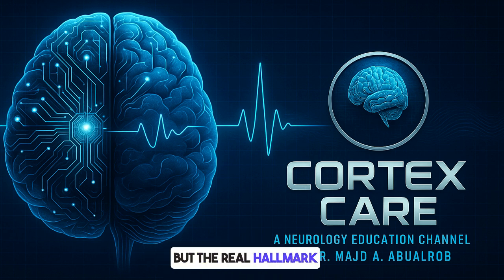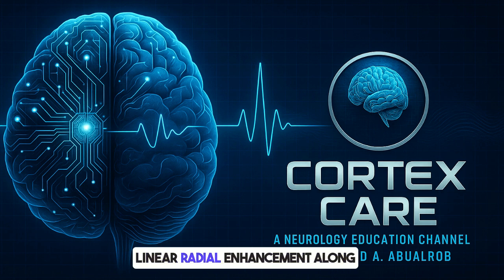But the real hallmark... What's that? Is a characteristic pattern of contrast enhancement, linear radial enhancement along the blood vessels, especially in that periventricular white matter, seen in about half the patients. Ah, a specific enhancement pattern. That sounds useful. Very useful when present. Leptomeningeal enhancement is also common.